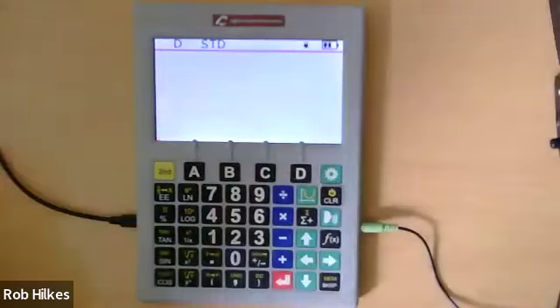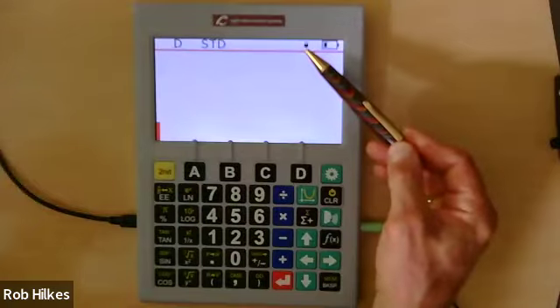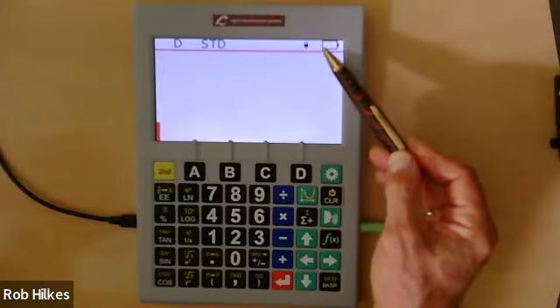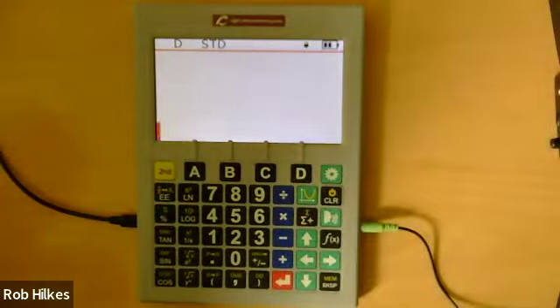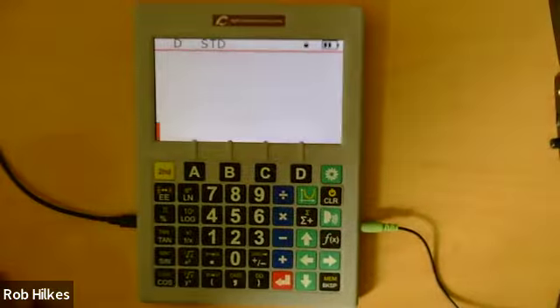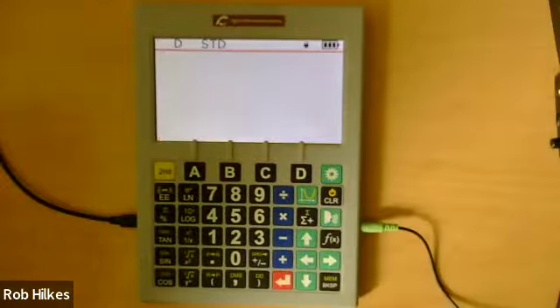That's why you see this little plug icon. If it's only showing one bar, plug it in, because, I'm thinking like an electrical engineer now, it might cause some register to empty out or something like that if the voltages inside are too low. But it shouldn't be a problem. I'm glad you found the reset, and I'm glad the problem's gone away, but keep an eye on it. Yeah, right. I'd like to know.